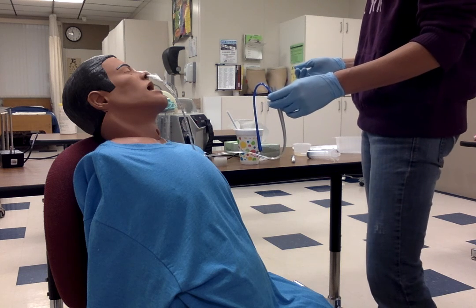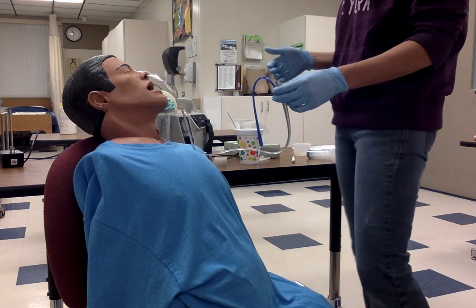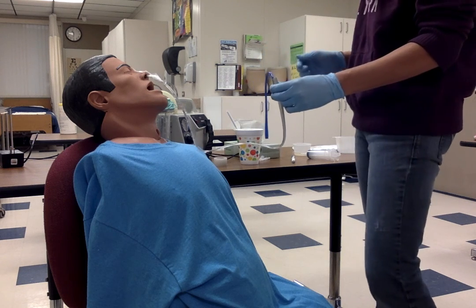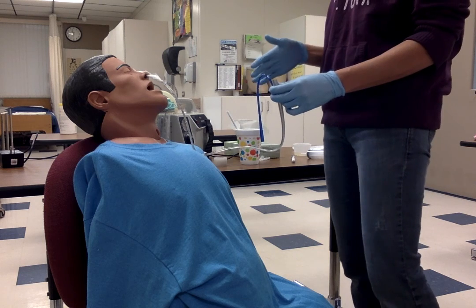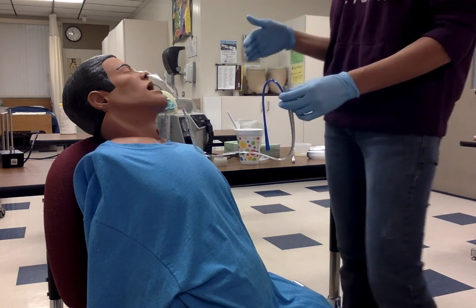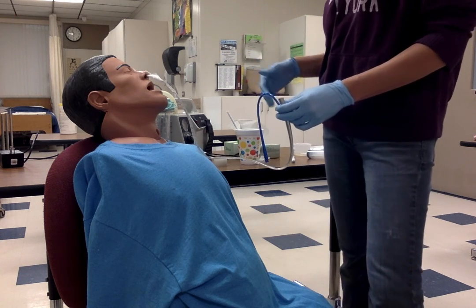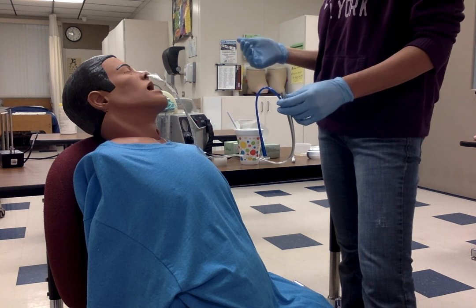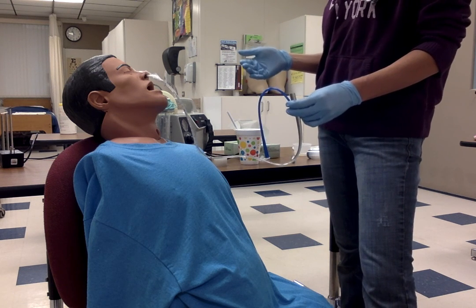So it's important that you check the pH and know the normal levels. And then also the x-ray placement is something that we do. And as nurses, once we have the NG tube placed, generally it would be our responsibility to go ahead and place an order to have x-ray come up and check for that placement.